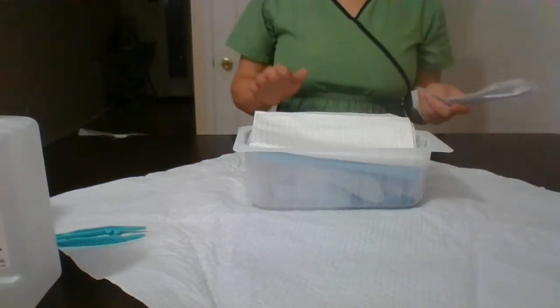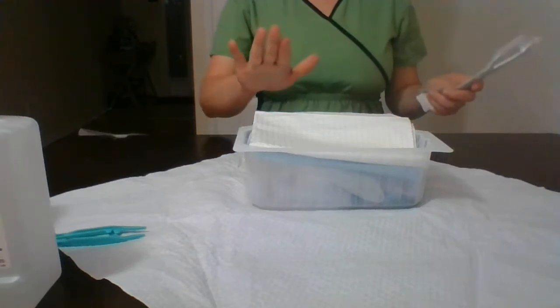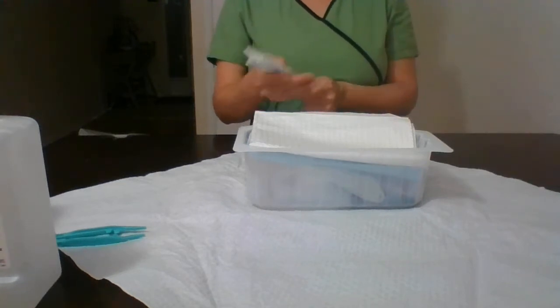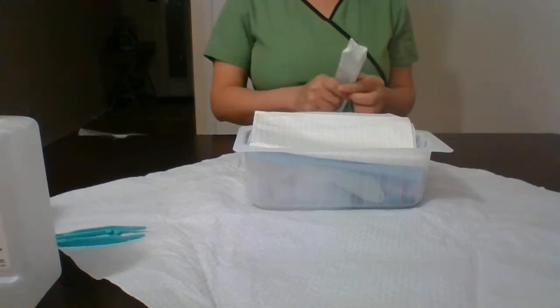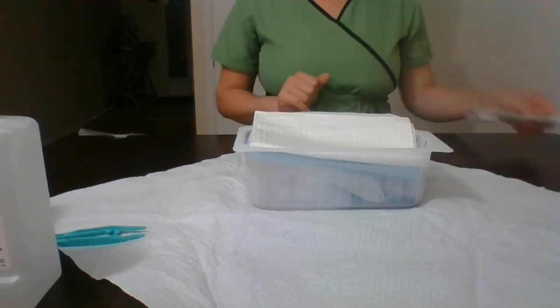I know I'm supposed to stay close to my sterile field. I just realized that my catheter fell, so I quickly grabbed it. But I know that I should not be leaving my field at any time.